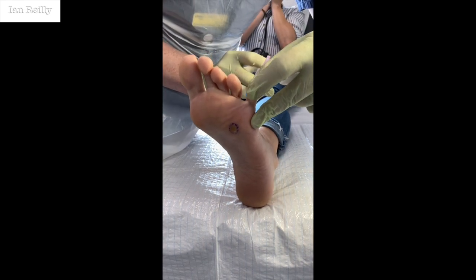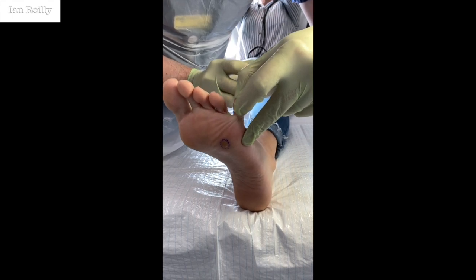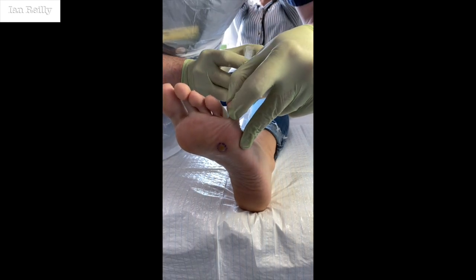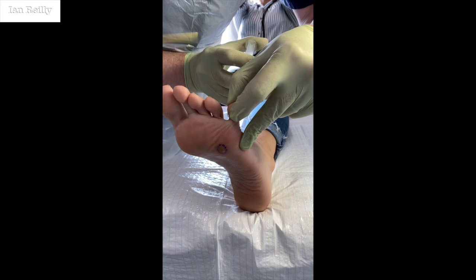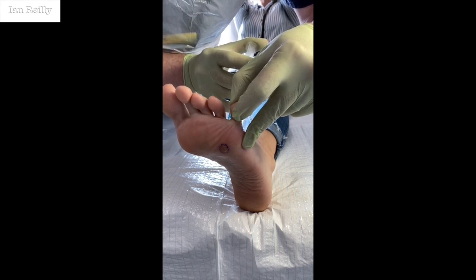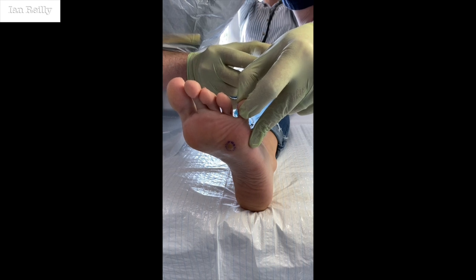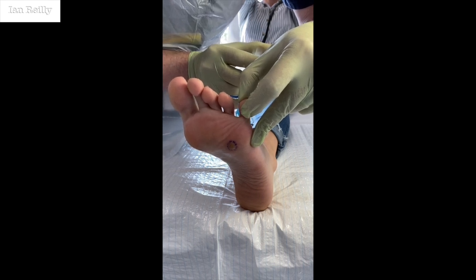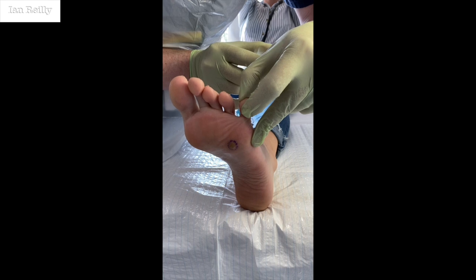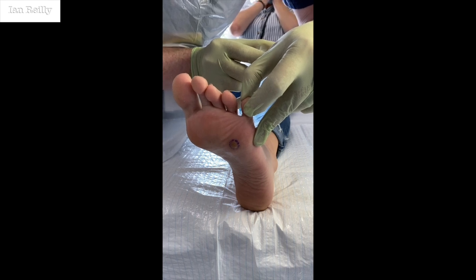A little scratch — are you ready? 3, 2, 1, scratch. It's going to be a little sting as it goes in just now. Are you feeling that little sting? How's that? I'm just working that deeper — I'm not all the way down yet — just going a little bit deeper as we get closer to that plantar skin.